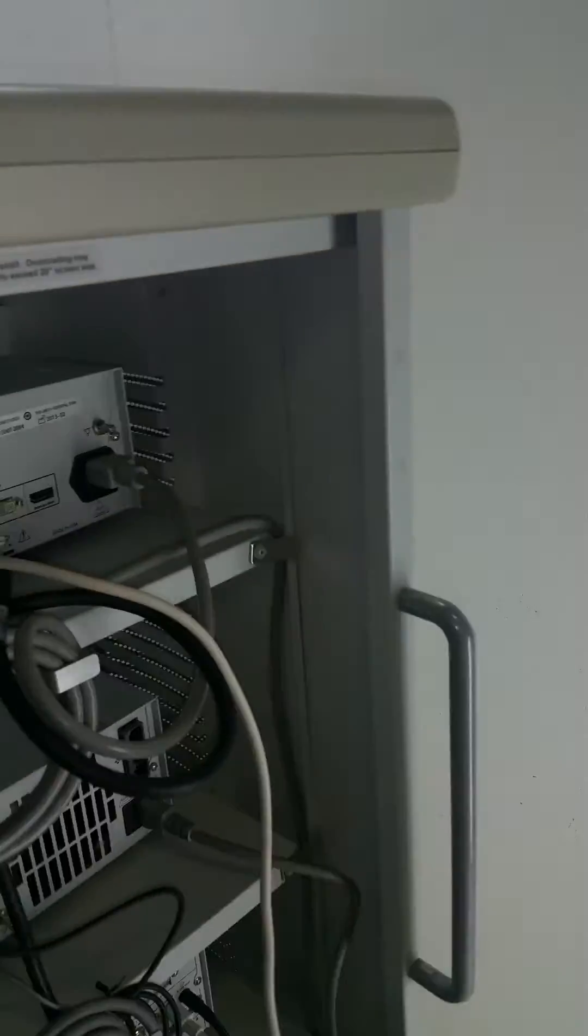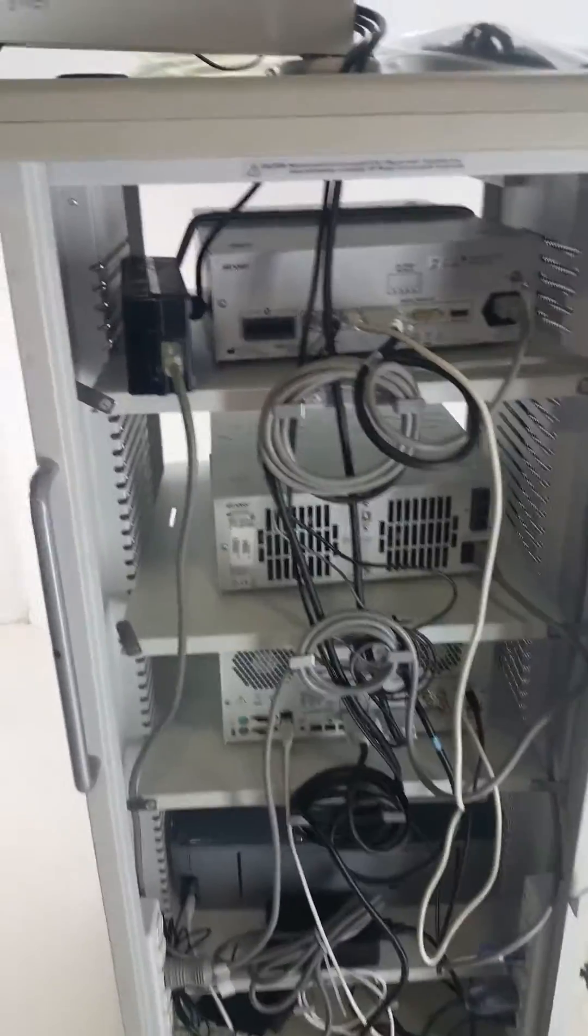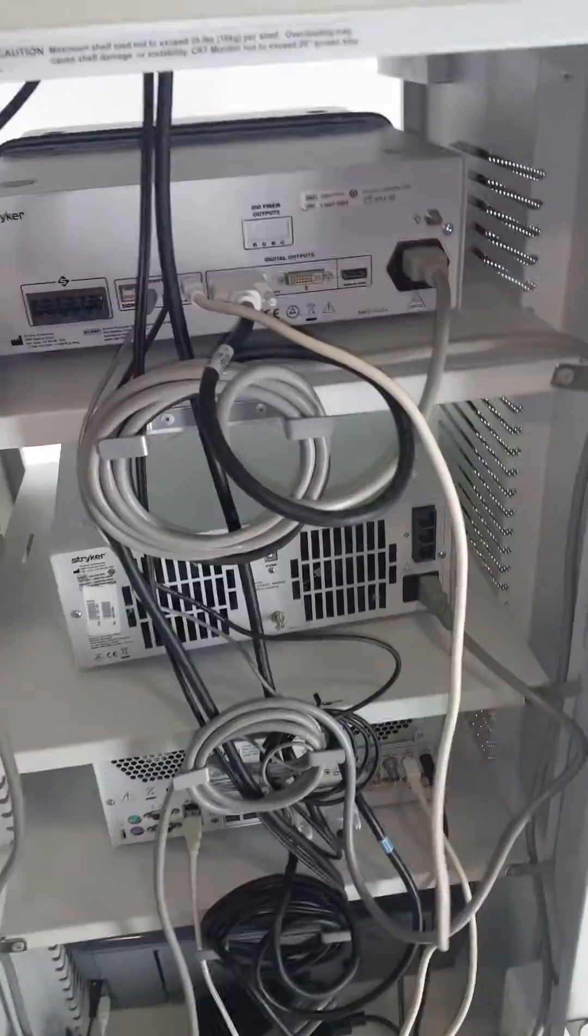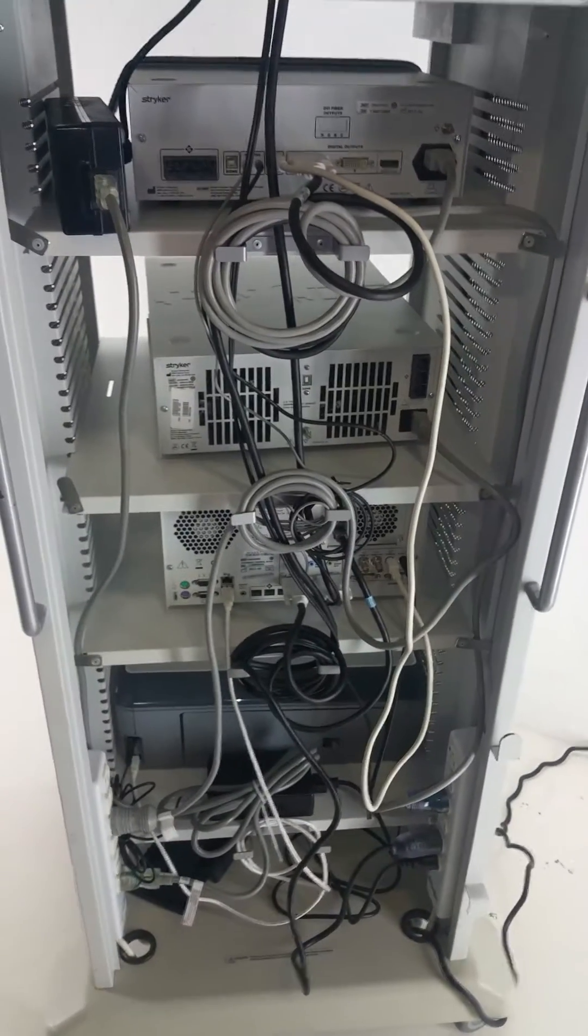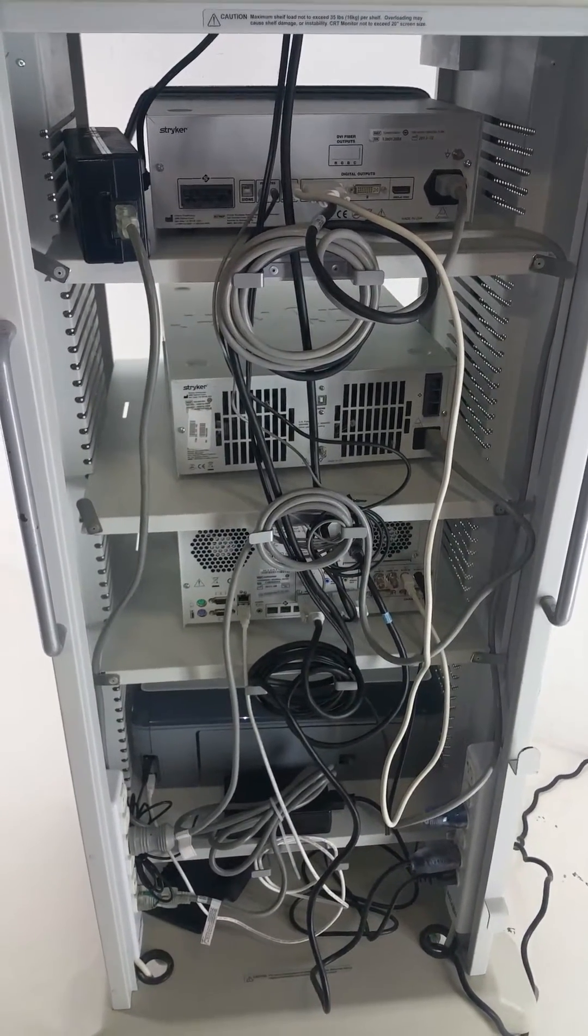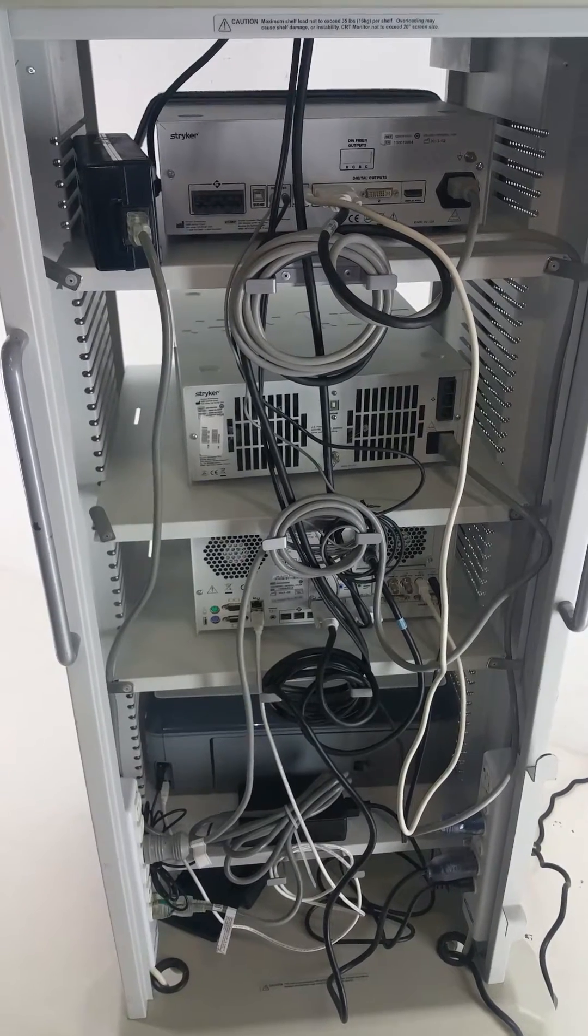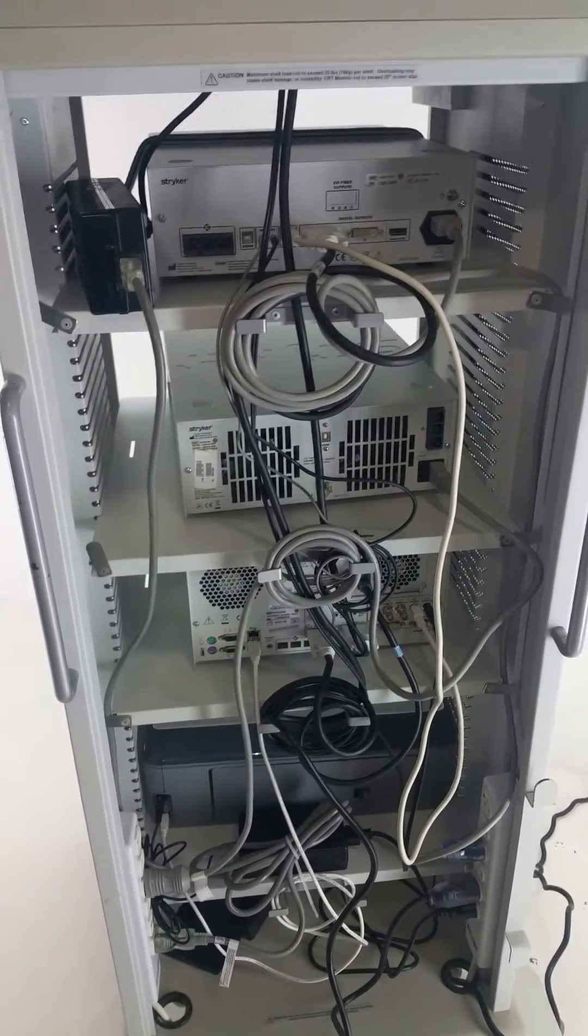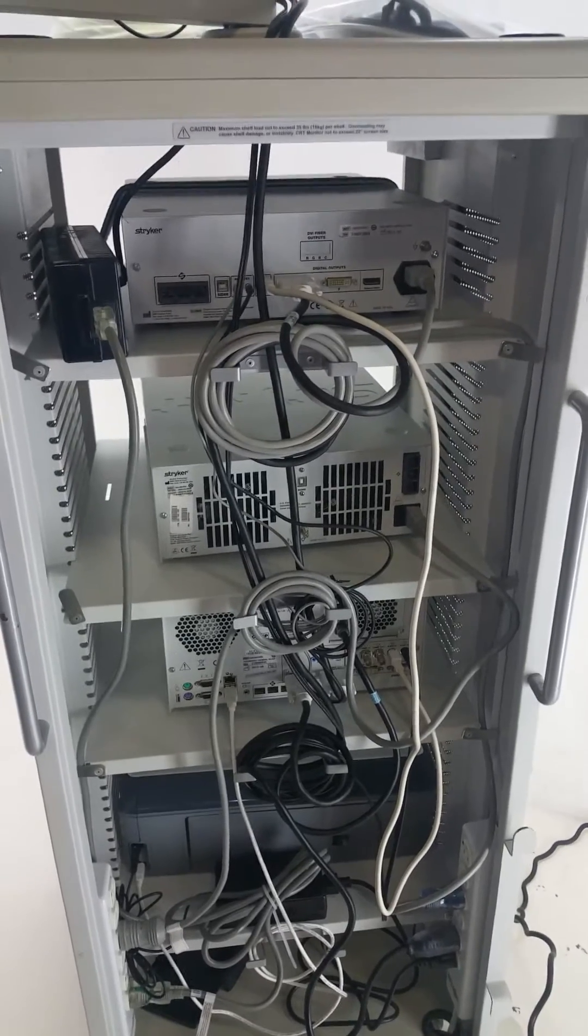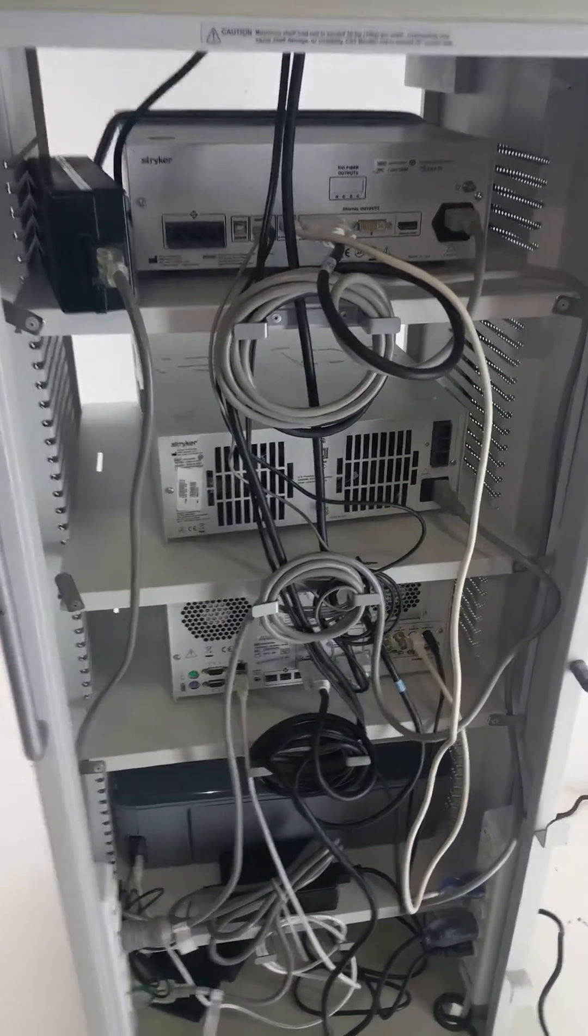it looks a lot more complicated than it is, I promise. But this will help you determine if something is just simply unhooked or something's not working. You can at least start here to verify that things are hooked up properly.